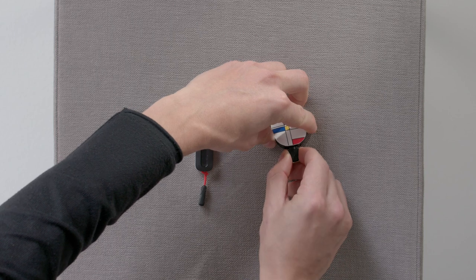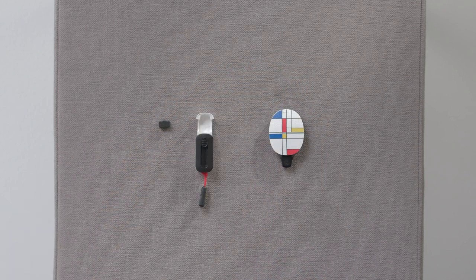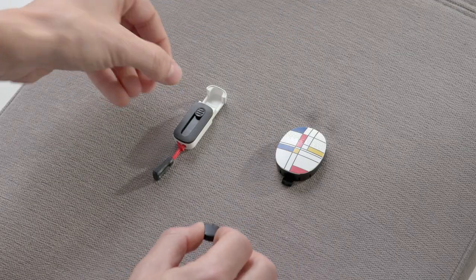RONDO3 will now automatically pick up the signal from the hearing loop or neck loop. To deactivate the telecoil function, remove the telecoil adapter from the audio processor.